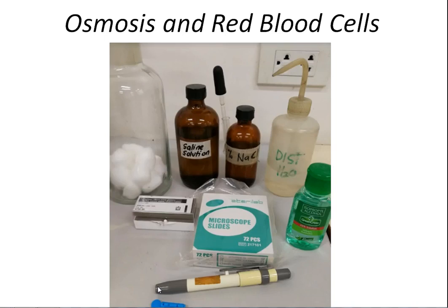Position the lancet opening against the fingertip and press the release lever until it clicks. Once it clicks, after some gentle squeezing of the finger from the base, a drop of blood should come out from our needle prick.